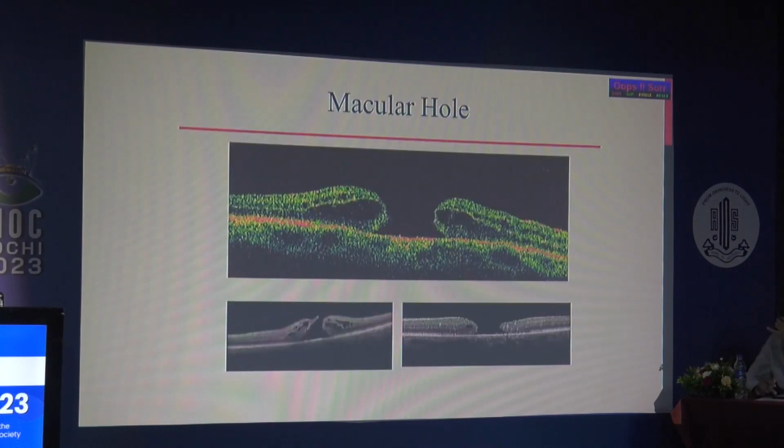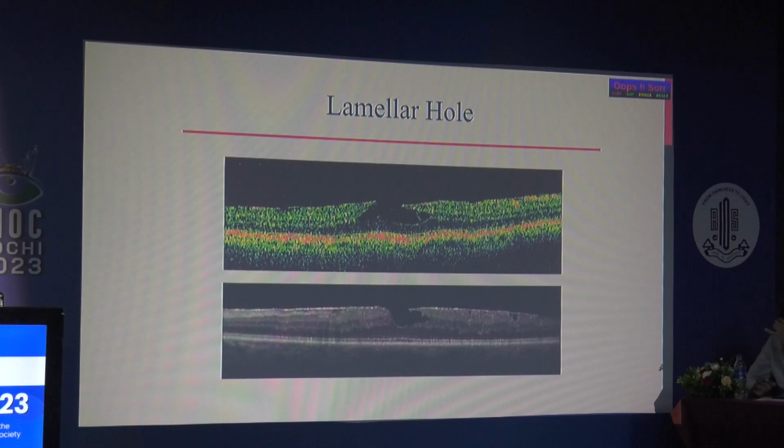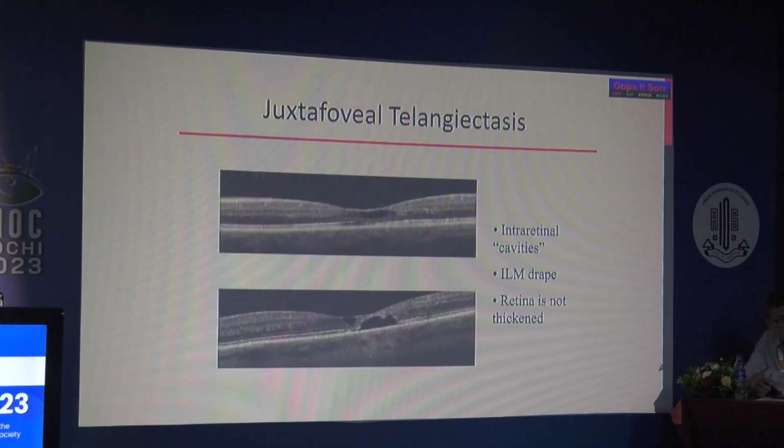So again, this is a very common picture that you are all aware of. This is again an important thing when you go for a hole analysis. If there is a tissue left, even if a minor tissue left, these patients possibly will not need surgery immediately. You can just follow up.